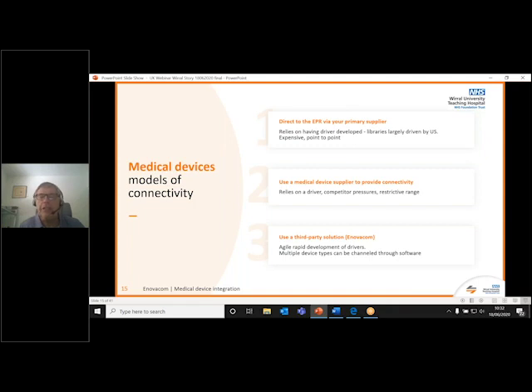And certainly one of my considerations when COVID started and everyone was desperately looking for ventilators, which happily we didn't need in the end, was if they do come and they're not one of the supported ones by our primary supplier or Draeger, how would we get connected? Because there'd be no way that in our organization we could have some ventilators running in a digital mode and some going back to a paper mode. It would just be unsafe.